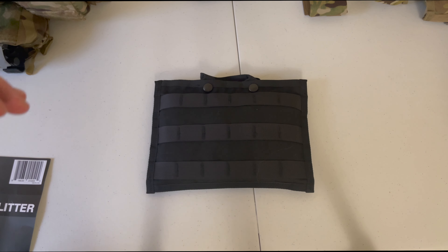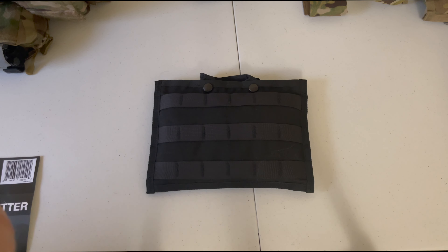Alright my dudes, so today we're going to be doing a quick review and tutorial of the TaqMed Solutions Phantom Litter.